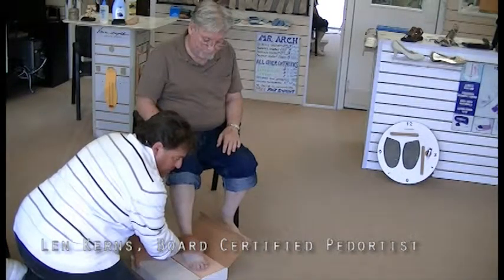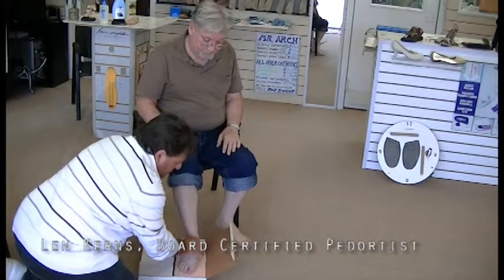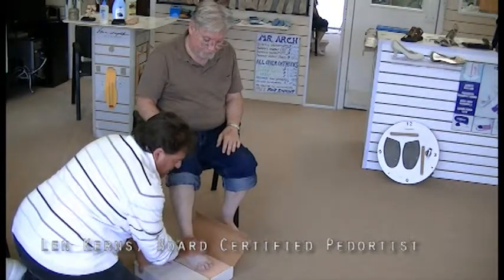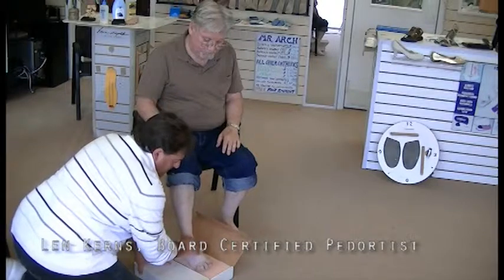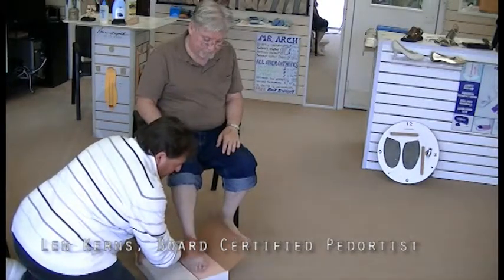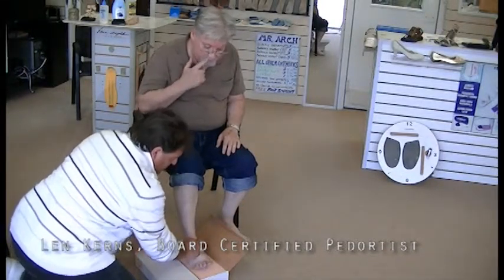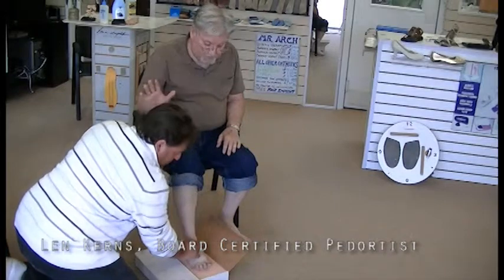I'm just moving the box a few times this time, just so you can get a feel to see what you have to do in your office. It's so easy. As I'm rotating this way, the whole ankle comes up. As I rotate this way, the whole foot pronates. And what I'm looking for is right where that talus and navicular bone absolutely lock in place. It's right there. The foot's in a comfortable position.